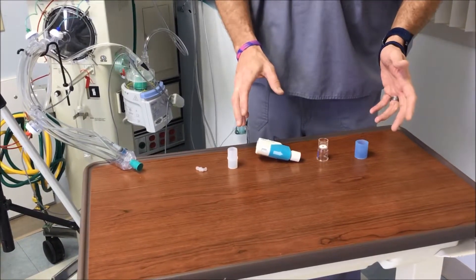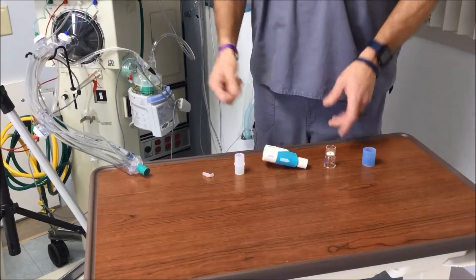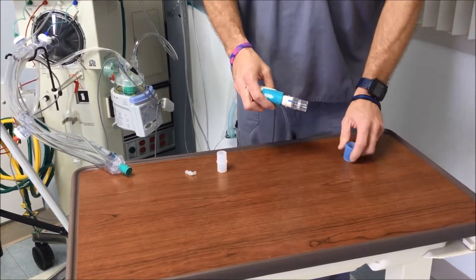We're going to connect the equipment and attach the injector module to the actual oscillator. Beginning with the one-way valve — you'll notice it has an arrow indicating the direction of airflow.